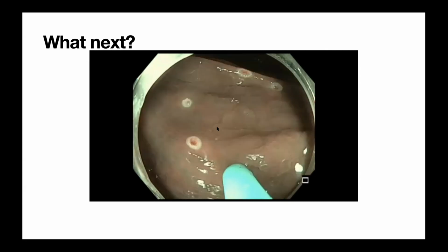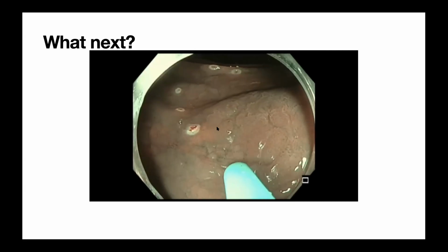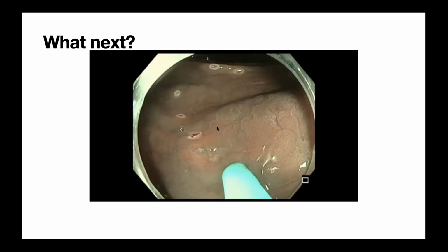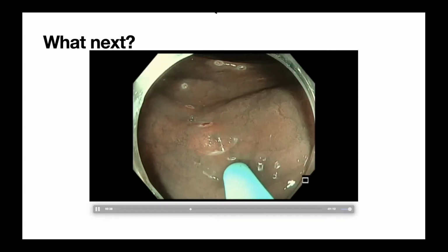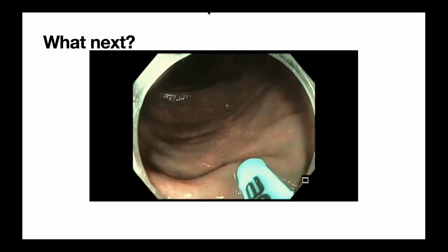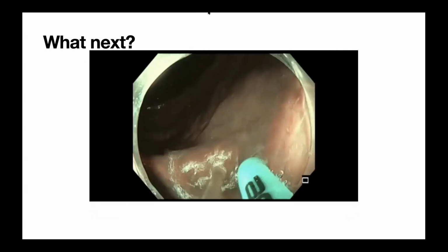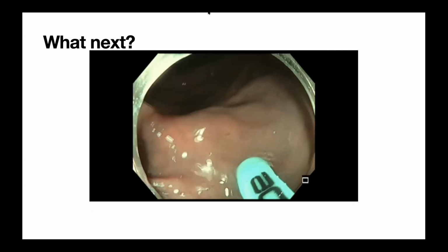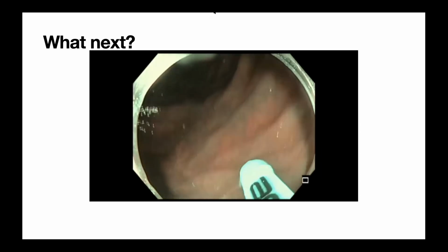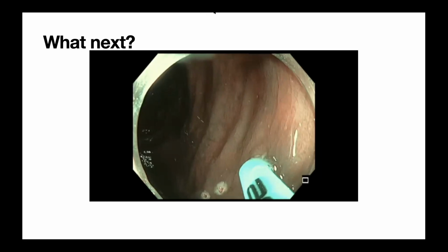But if you have an adult scope and you have a near focus, you can define the transition much better. But you can see the transition, right? On the left side is normal. On the right side, there is a little bit of granular appearance. It's an SSA, no? It is an SSA. Yeah, looks very much like an SSA. It has a positive O sign. All right.